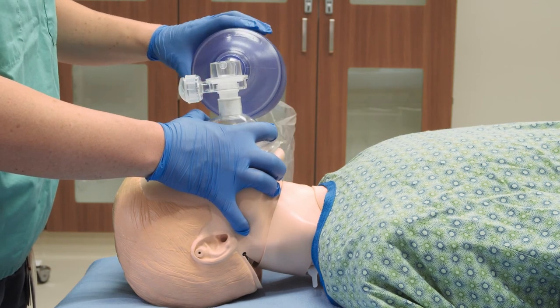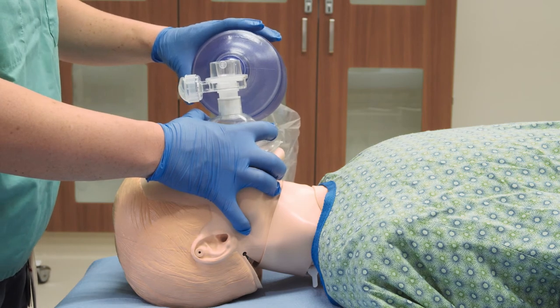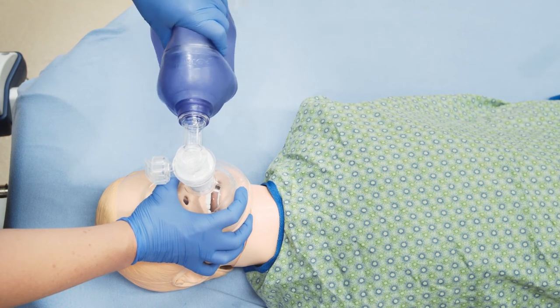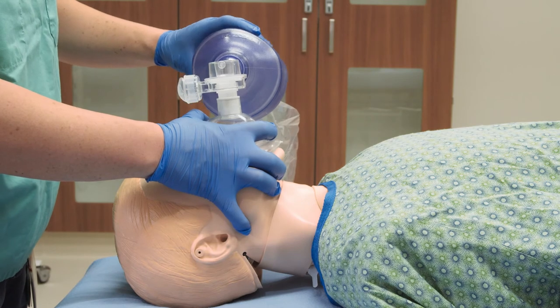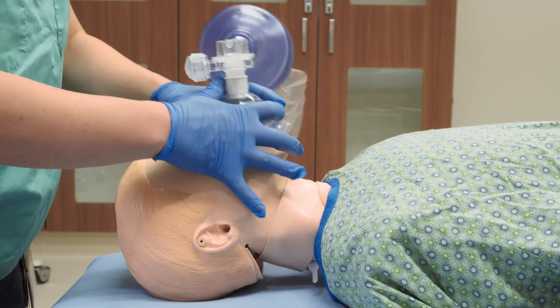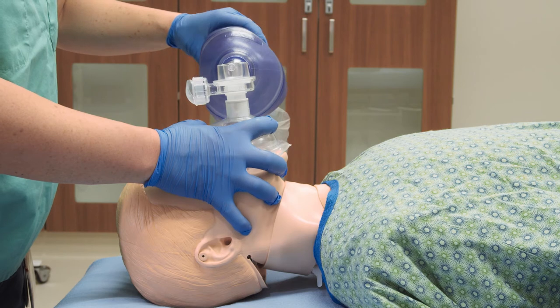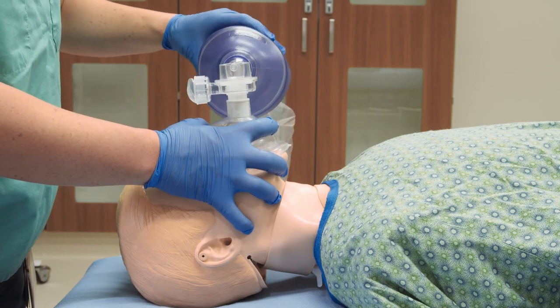Think about pulling the face up to the mask and pushing the mask down onto the face. If you push down too hard without pulling the face up to the mask, you will block the airway and the patient will be difficult to bag. If you have problems ventilating, reposition your hands and the mask and try again. If you are still unable to ventilate after repositioning, consider the possibility of a foreign body obstruction or air leak.